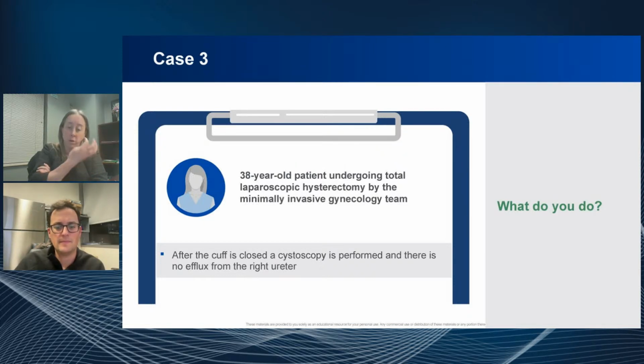And then there's just certain things you work through. You can open up the fluids, try to hydrate the patient a little bit more. I will give the 10 of Lasix. I mean, we kind of go through these steps. Give the indigo carmine. And if you're seeing it jetting repeatedly from the left and not in the right, then you have to go back and try to find out which stitch.